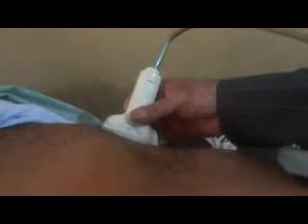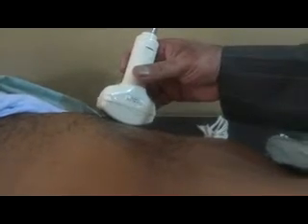The patient is in left lateral decubitus posture. I will place the probe in the mid subcostal region — almost the mid of the subcostal region — and place the probe perpendicular at this location.